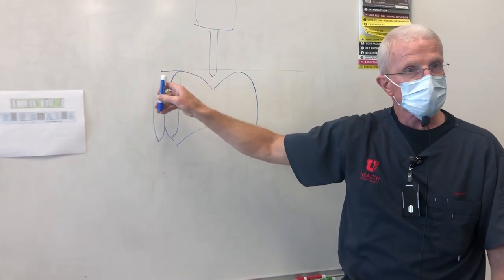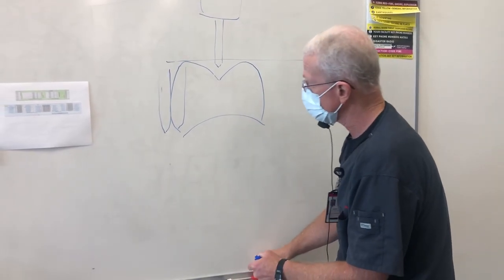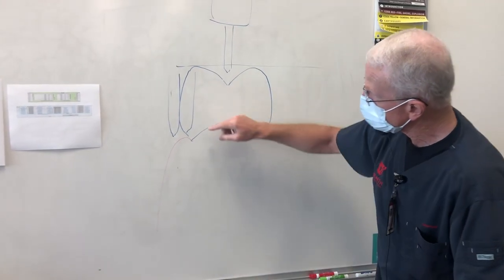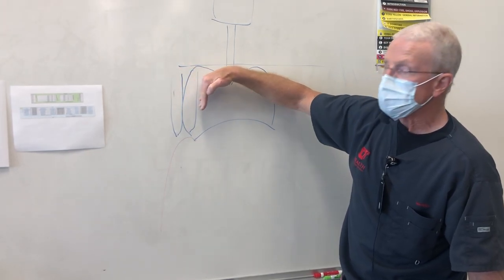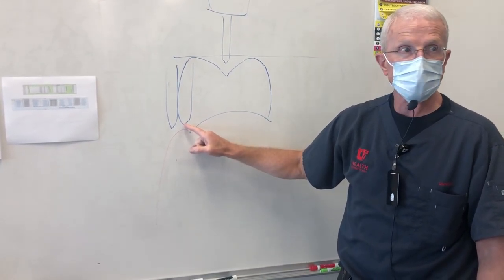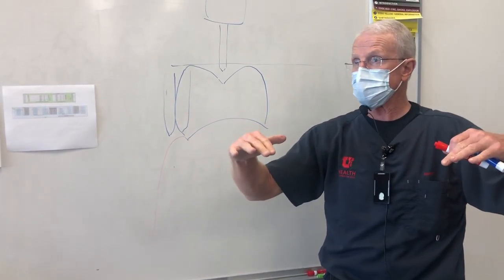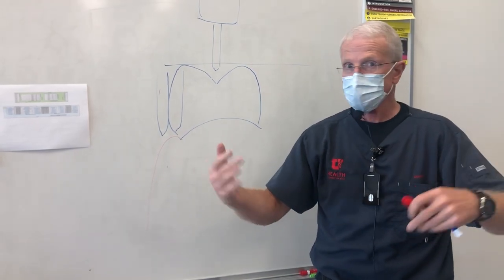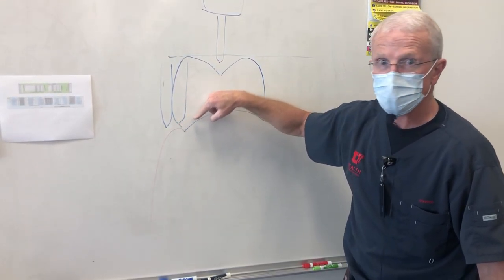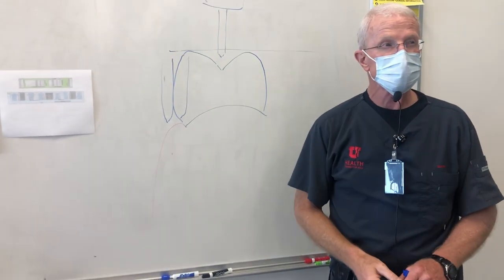or you're approaching your axial depth as you get to your supragingival height. You want to do that about the same time, right? So get your axial depth almost finalized. Your gingival margin, you want to get close, but you want it supragingival, right? You want to have room to correct errors in case you slip off or you J-lip or whatever it is. And as you get close to your axial depth, then focus on finishing that gingival margin right along the buccal aspect. Does that make sense?